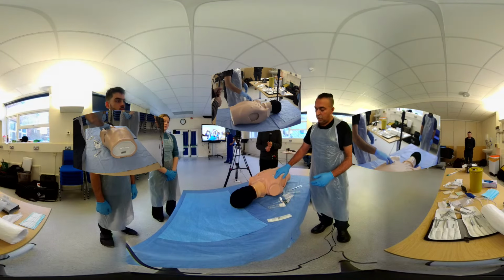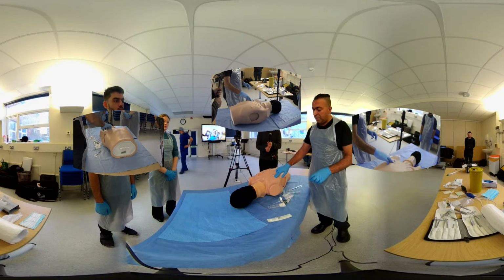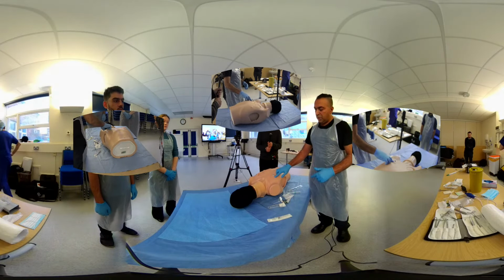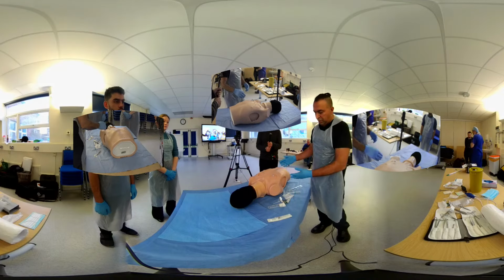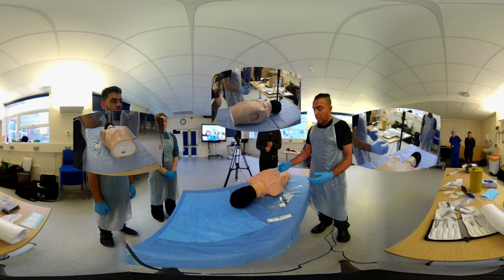Now, if you were to hit the neurovascular bundle, which is below the rib, that would actually make the situation a lot worse. So that would potentially make this into a tension haemopneumothorax. So internally, you've actually got blood inside, potentially arterial venous blood going inside, as well as a tension. So you need to avoid that.